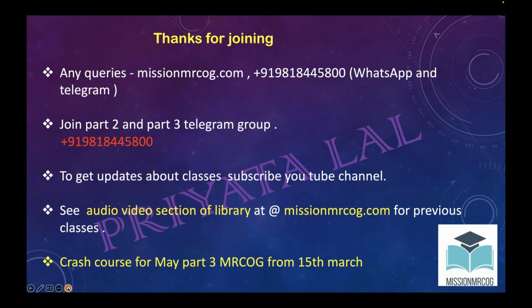See, in the red category, you will put that red. But in red also, first you will do conservative measures. You will see the overall picture. Maybe on continuing assessment, the fetal heart rate will come down. Then you will recategorize it and laboring monitoring is to be done. But if you have done conservative measures and see all other features also and it is permanently red, there is no change, then you have to do expedition.